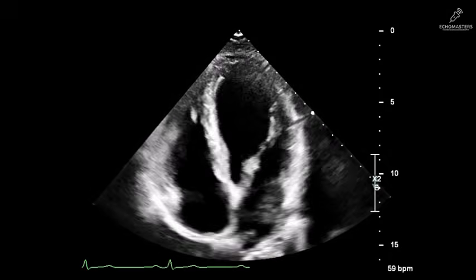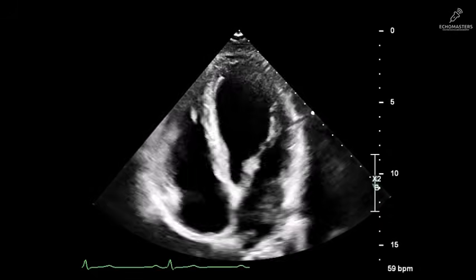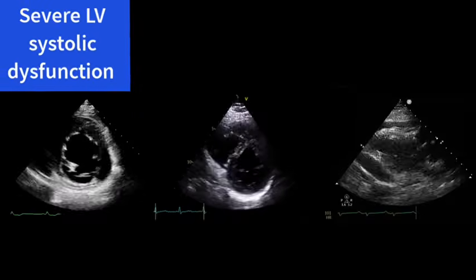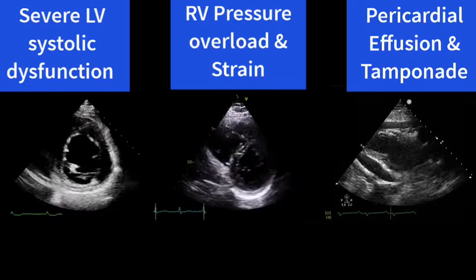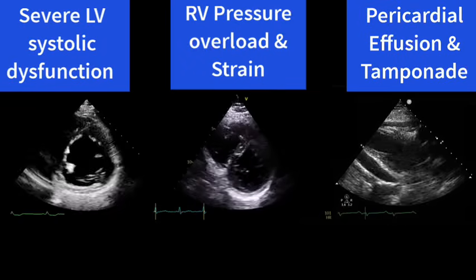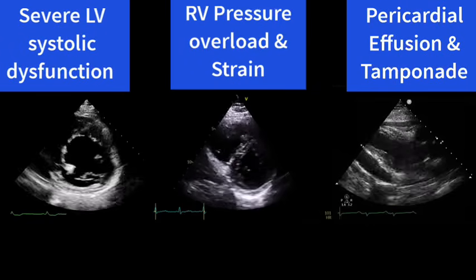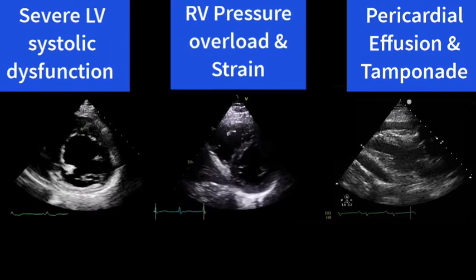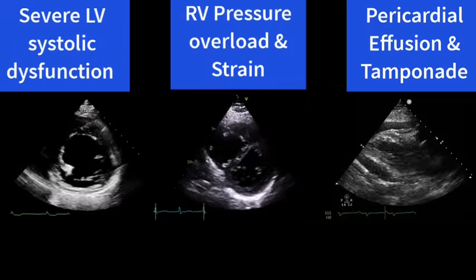So, how do we master that apical window to get that crucial view? That's exactly what Module 3 is all about. And just to emphasize, these are simple hints for the red flags you can identify through your parasternal window. We are still in our foundational modules, mastering these basic views and how to get the views. In the future, we will have dedicated lessons that dive deeper into red flags and emergencies. For now, we have a strong foundation. Let's move on to Module 3 and unlock the power of the apical views. See you there.